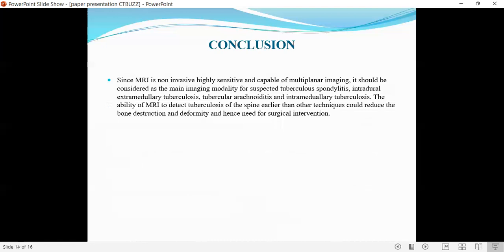In conclusion, since MRI is noninvasive, highly sensitive, and capable of multi-planar imaging, it should be considered as the main imaging modality for suspected tubercular spondylitis, intradural extramedullary tuberculosis, tubercular arachnoiditis, and intramedullary tuberculosis. The ability of MRI to detect tuberculosis spine earlier than other techniques could reduce bone destruction and deformity, and hence the need for surgical intervention.